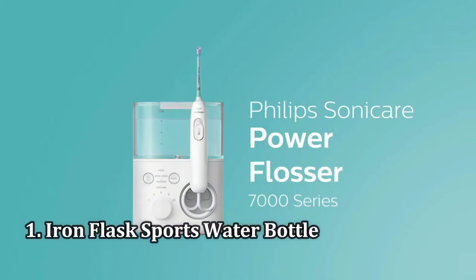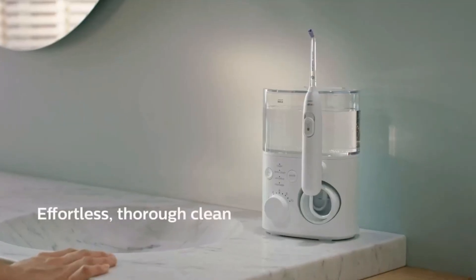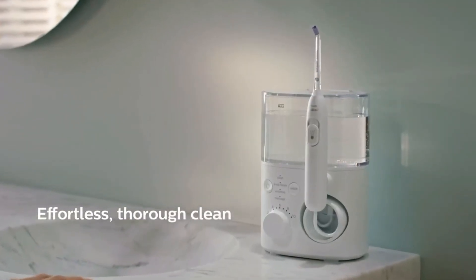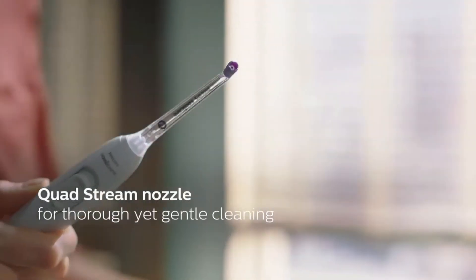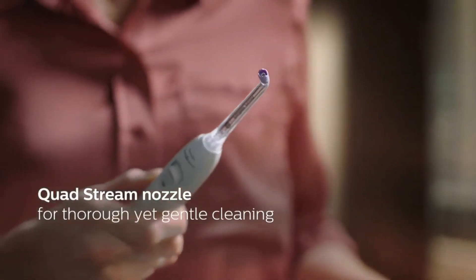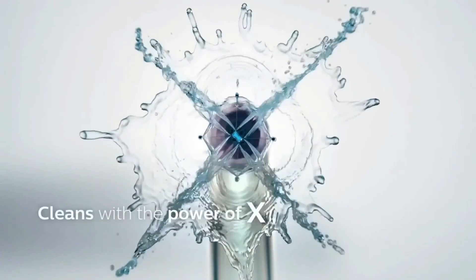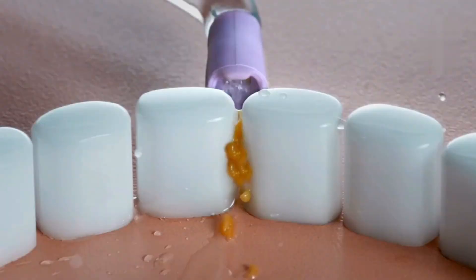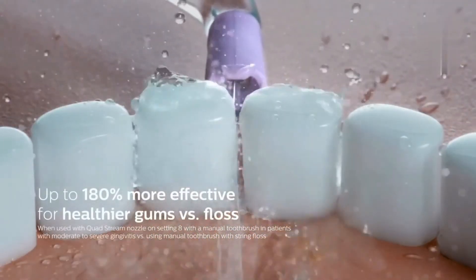Number 1: the Philips Sonicare Power Flosser. A water flosser that does it all exists, receiving only plus marks for its mess-free deep cleaning, easy use, and sound that won't disturb in the AM. This Philips Sonicare rated 96% in overall satisfaction among consumer testers, with one describing it as their all-time favorite in their 20 years of water flosser use.